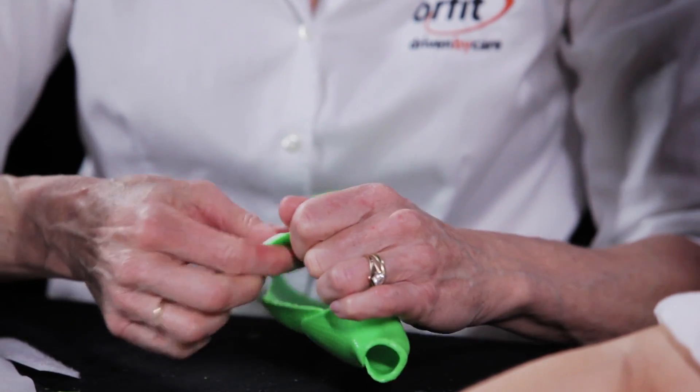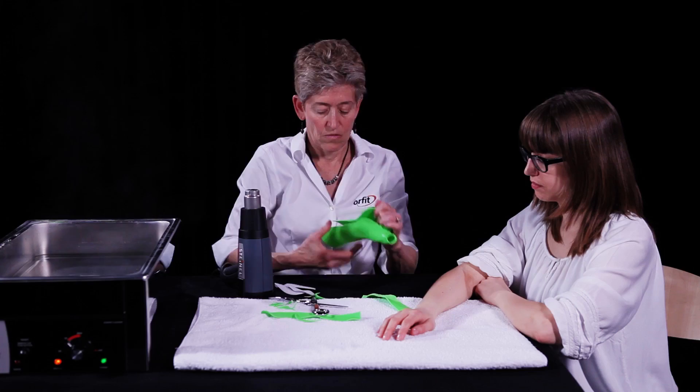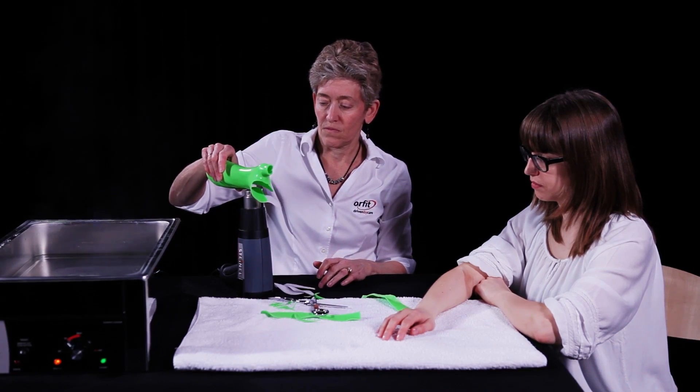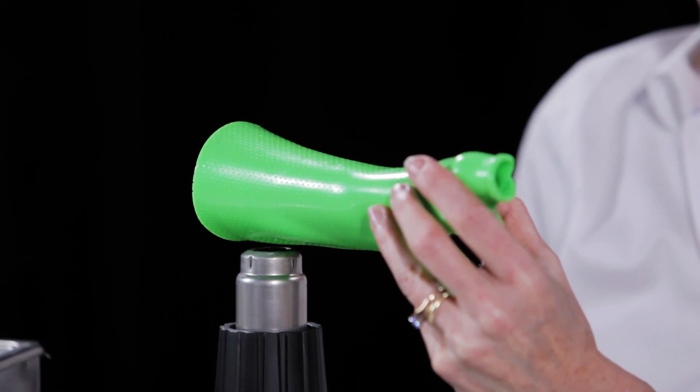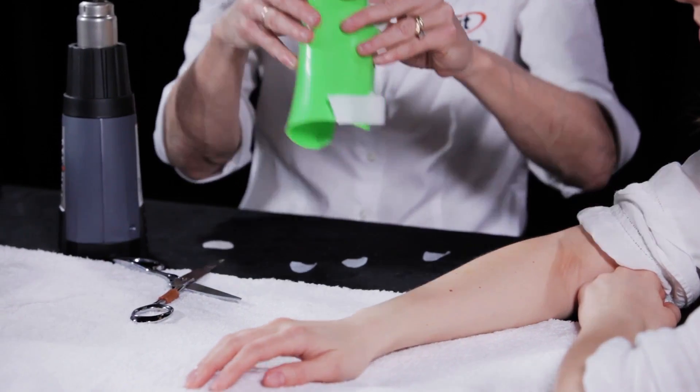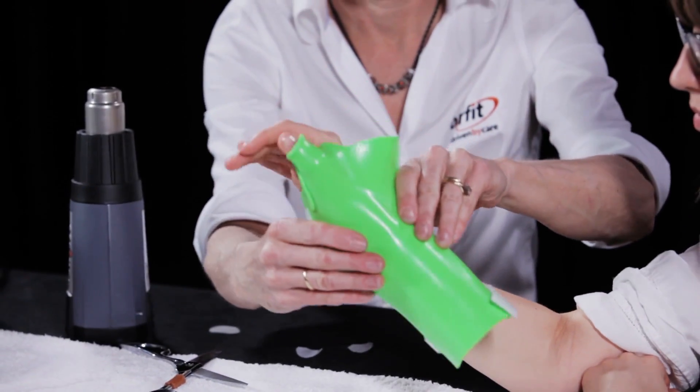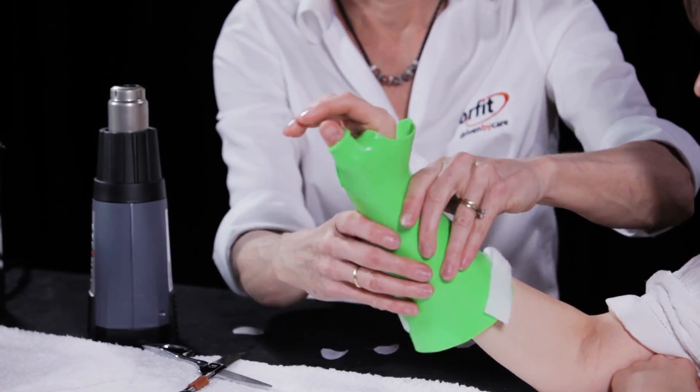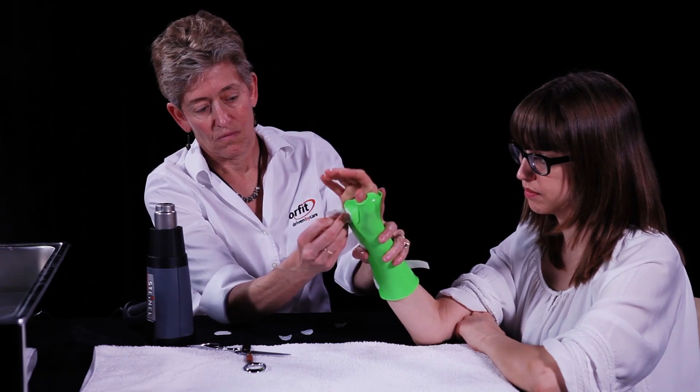Firmly press the Velcro loop strap into the heated thermoplastic. Repeat for the two additional straps. Apply adhesive backed Velcro hook on the opposite side of the orthosis. Make sure this hook stays in place by dry heating this adhesive and also by dry heating the thermoplastic material.